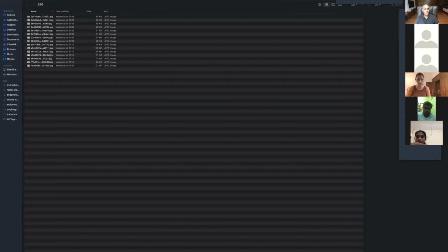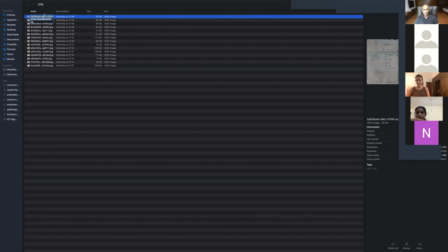Can you see my screen? Right. But I don't know how this is going to work out. I'm just going to click on this. Can you see this trace, children?